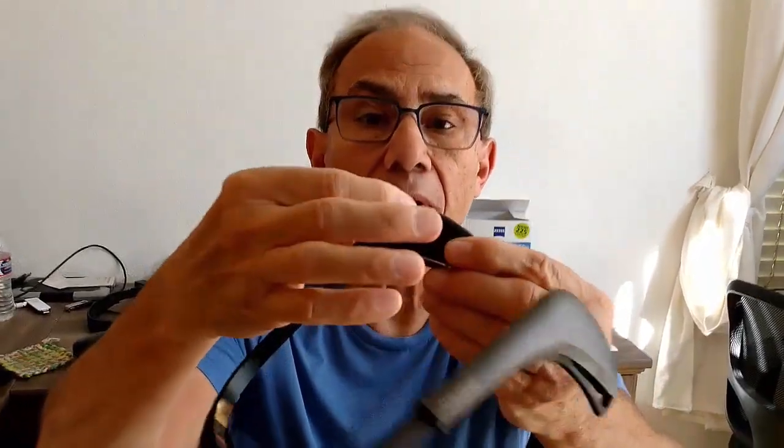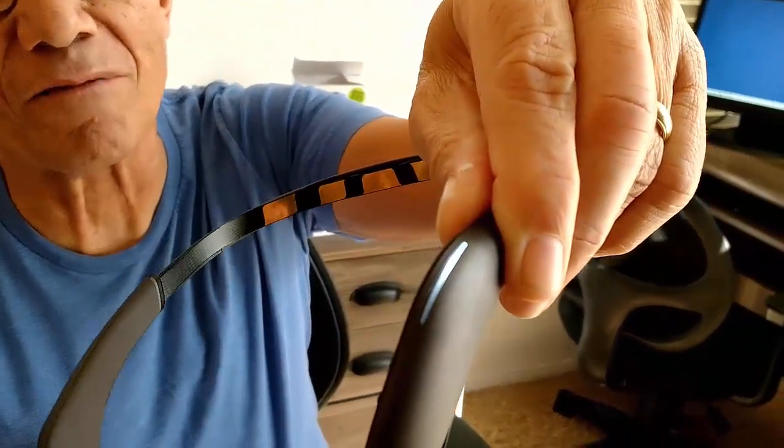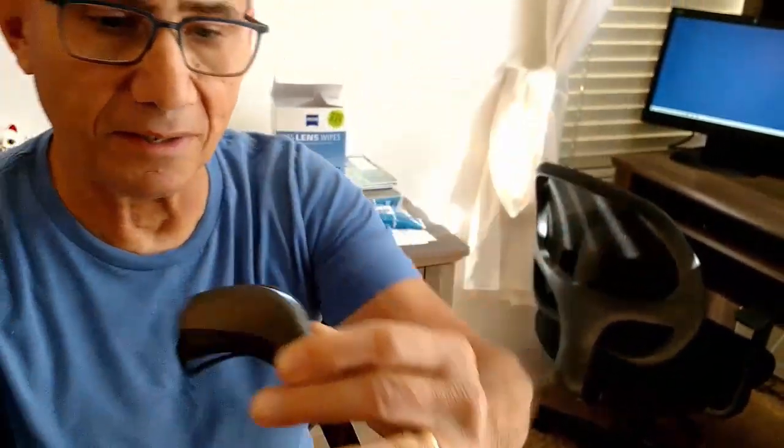So let's start. The first thing is you need to pull those out. This is supposed to fit on your head. And before you put it on, because if you forget this, then you have to take it off and do this again, here's the on switch right here, that little button right there. So you're going to turn it on like that, and then you're going to see those little lights flashing back and forth like that. And now I'm going to just take this on.